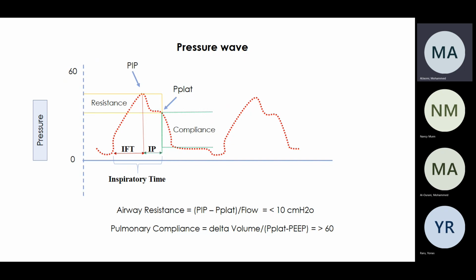We don't know exactly what the normal compliance is for this patient, but there are patients who have ARDS with normal compliance, and it doesn't mean anything. It doesn't mean we change the management or do a different scenario. Looking at the compliance for myself, I look for improvement. If I come today and do a static compliance, do my interventions and my recruitment, and then recheck my static compliance, if it's improving, I know there is recruitment of the lung.